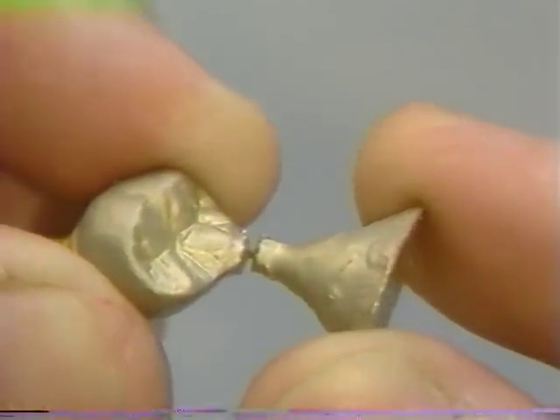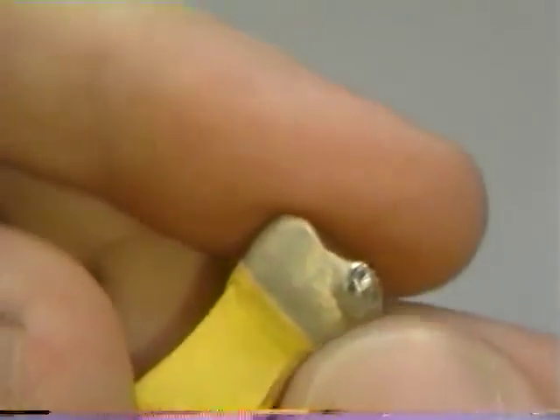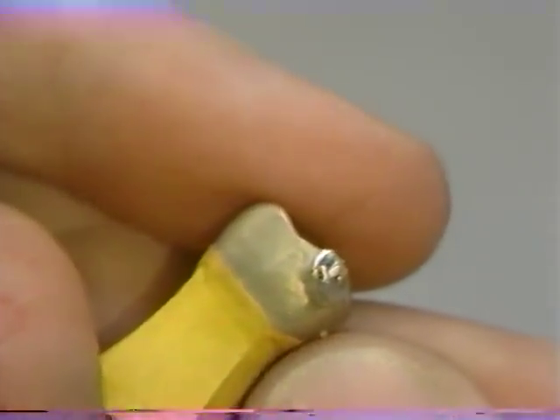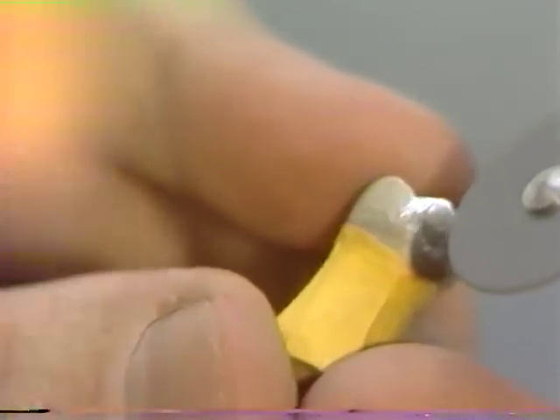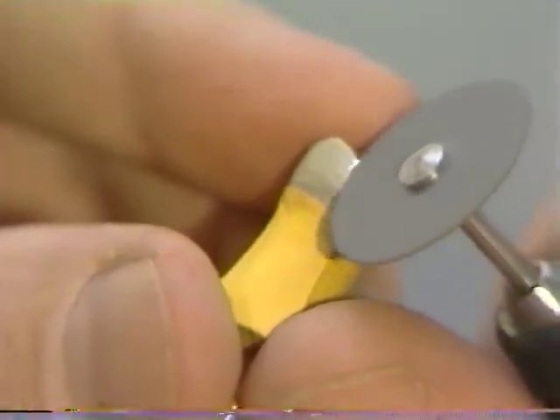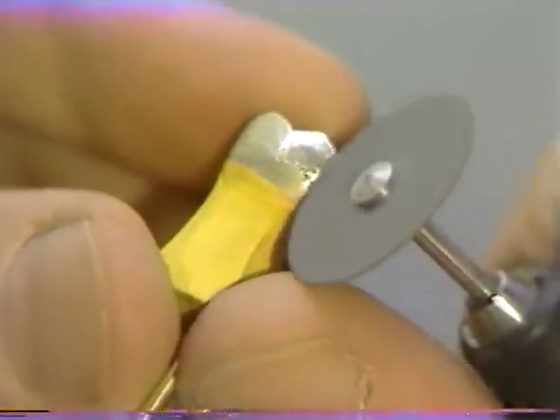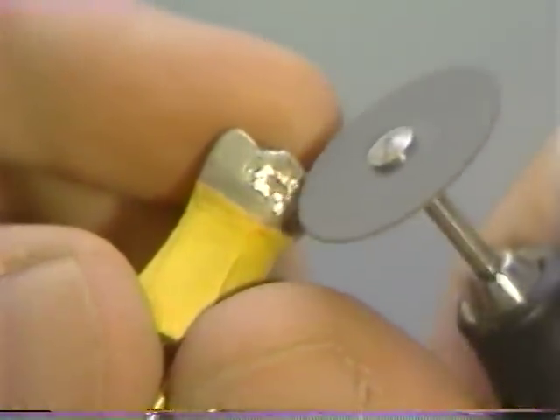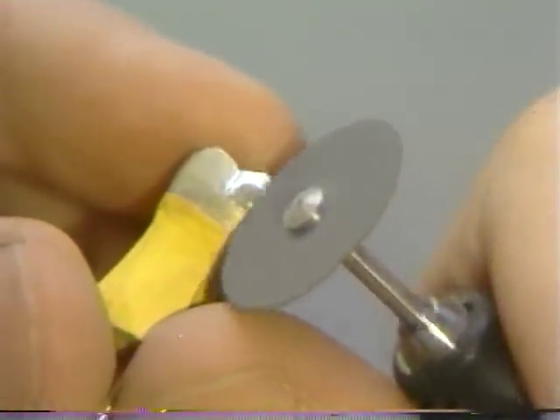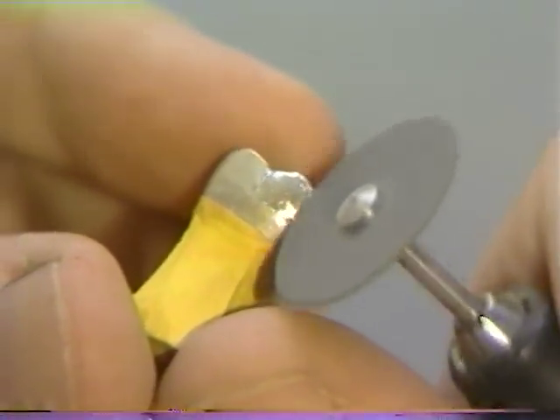The button can then simply be twisted off and any remaining excess is dressed down with the disc. The remaining portion of sprue is removed with a separating disc, and the original contour that existed in wax is re-established with this highly abrasive disc.